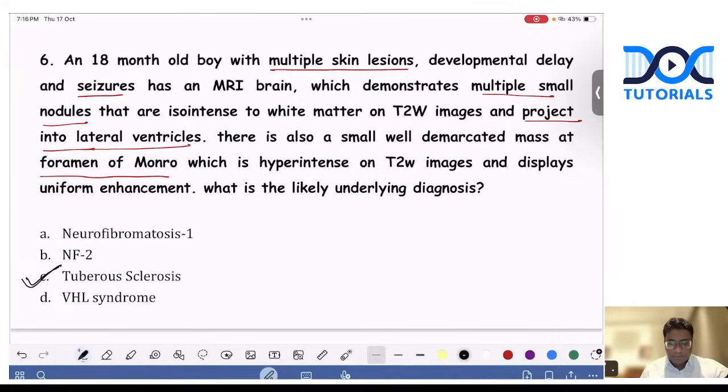Tuberous sclerosis. Please remember, the most common finding in tuberous sclerosis is the ash leaf macule. Multiple small nodules projecting into the ventricles are subependymal nodules, just around the floor of the ventricle, which are isointense to the white matter. And at the foramen of Monro, this is the SEGA, subependymal giant cell astrocytoma. These are the clues towards tuberous sclerosis, Bourneville disease.